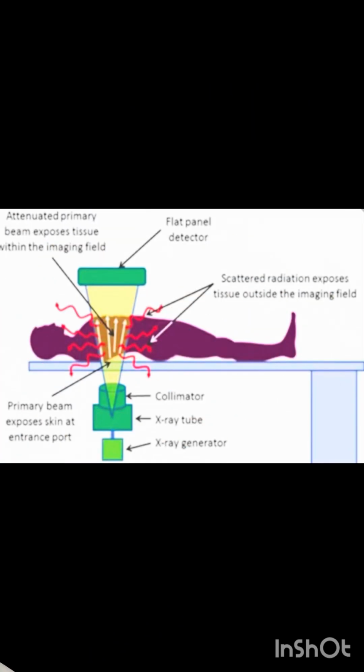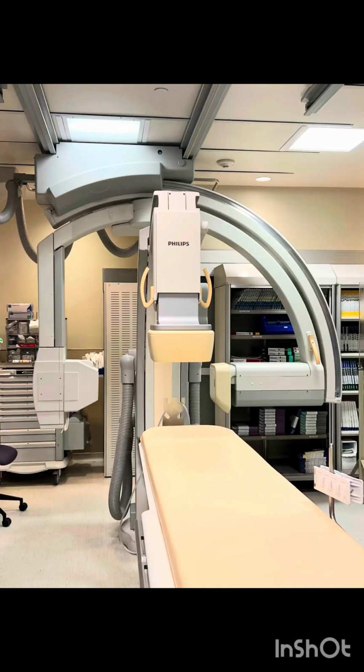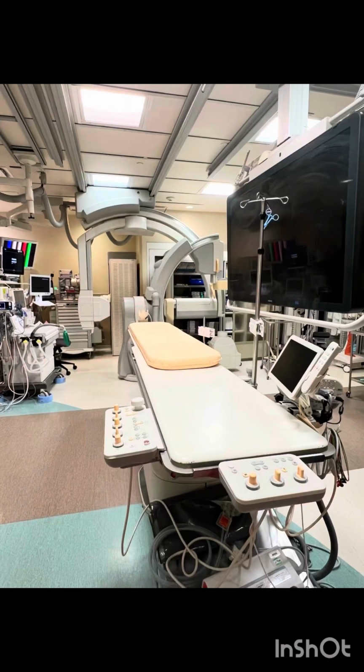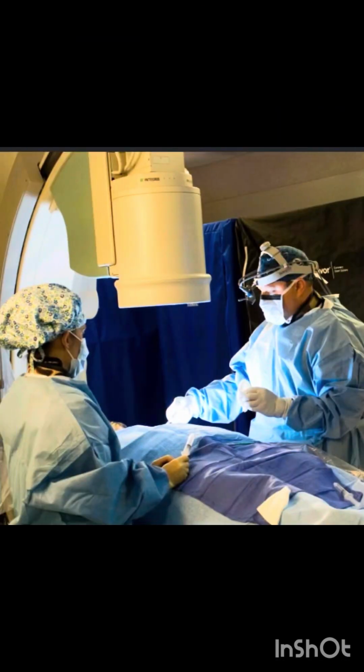In order to establish a smooth, safe, and effective environment, it is essential that we make sure our equipment is warmed up and functioning properly. We prepare the iodine-based contrast, including dose and setup. We verify that the sterile field has been set and is ready for catheterization. We ensure there is enough lead, aprons, goggles, thyroid shields, etc., for the entire team. We verify the patient's name, date of birth, and MRN. And lastly, we review the patient's medical history, especially any potential known drug allergies to contrast media.